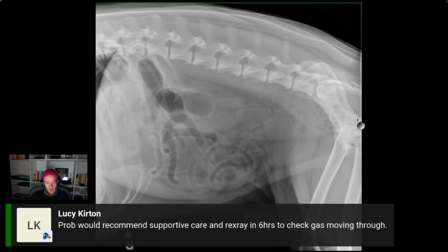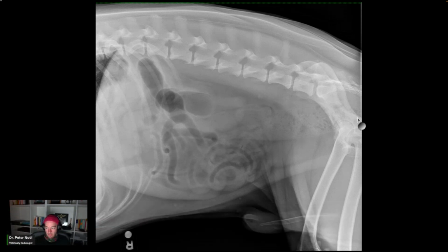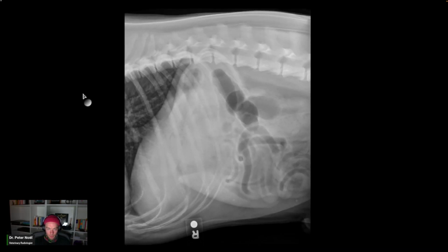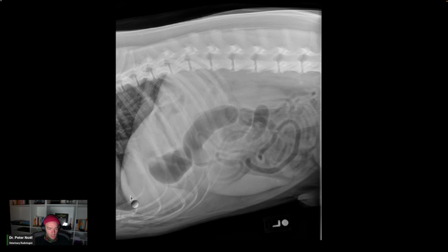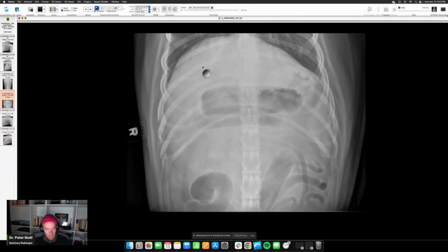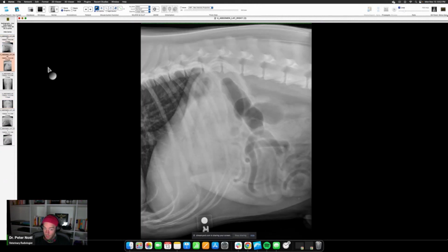Yeah. So they took this radiograph because they want to make sure that the dog doesn't have an obstruction. So I don't see anybody that's worrying that the animal has a GI obstruction. Going through, I'll just give you what I do to go through the rad. I approach the caudal thorax first, to make sure we're not going to miss pneumonia. You're more likely to see that on one of these left lateral views where you can cheat and get a little bit over here. So left lateral view, right lateral view, VD view even. Look in here, you'll see things. So caudal thorax, I'll just describe it as normal.